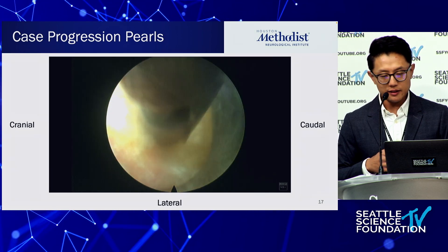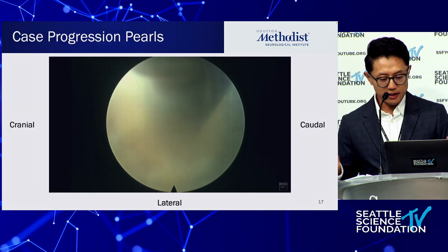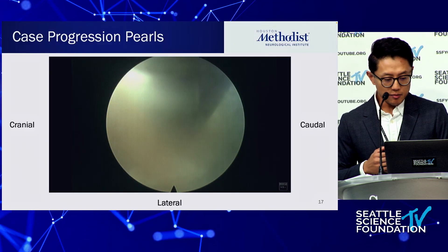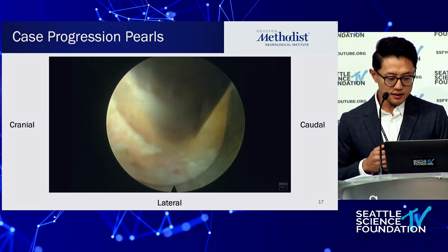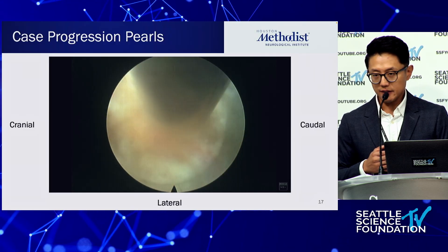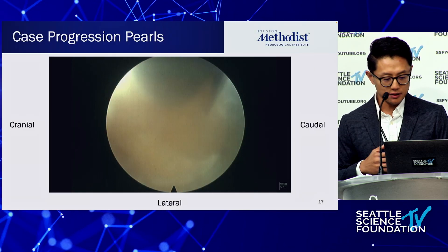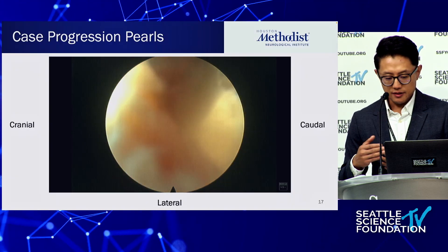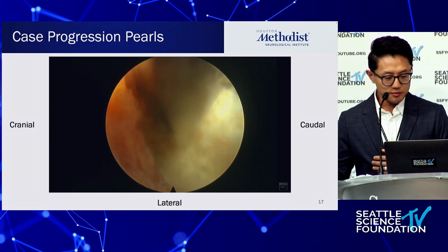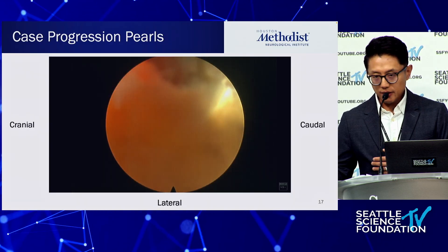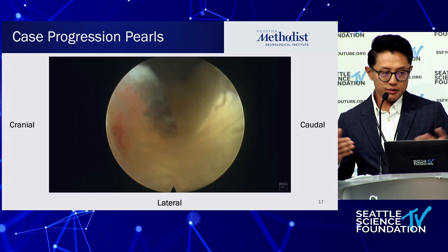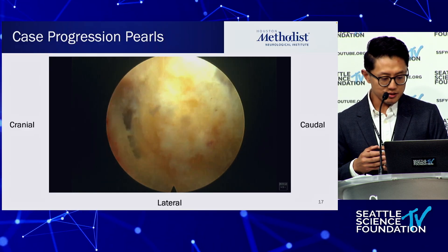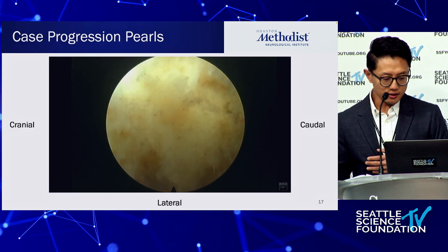Once you get to the laminar edge, continue to expand your interlaminar window. Once you expand the interlaminar window and identify that rostral vertebral lamina drop-off, you can find your ligamentum flavum, expose it, and drill as necessary. In this case I decided to drill, especially because part of the disc herniation was lateral into the proximal foramen.